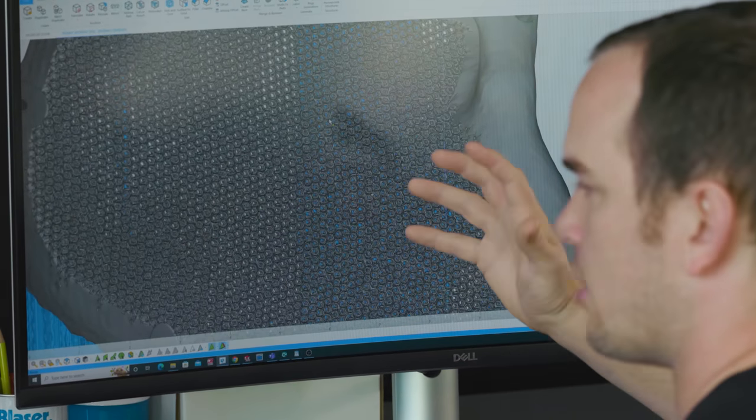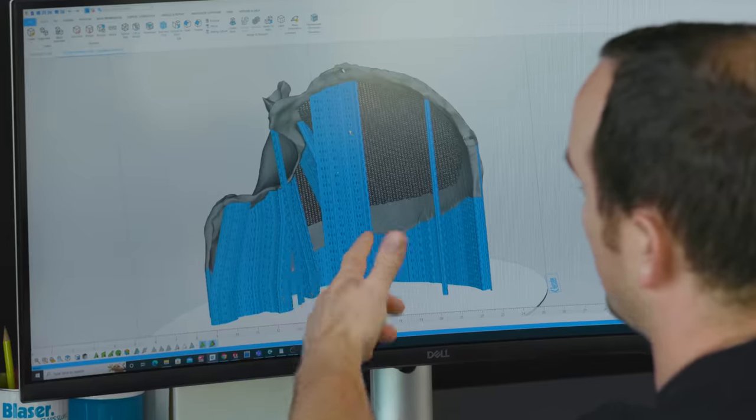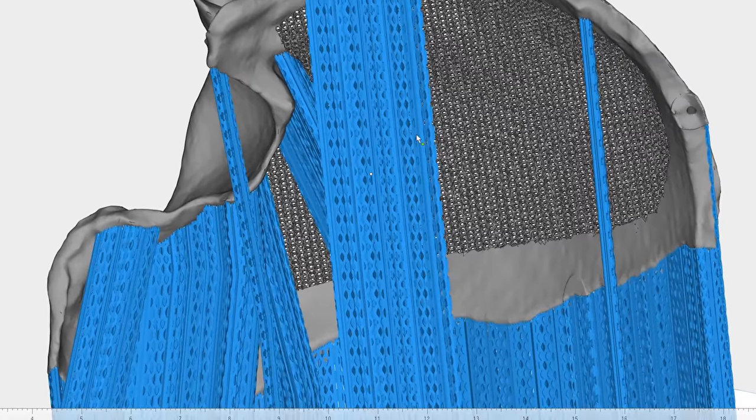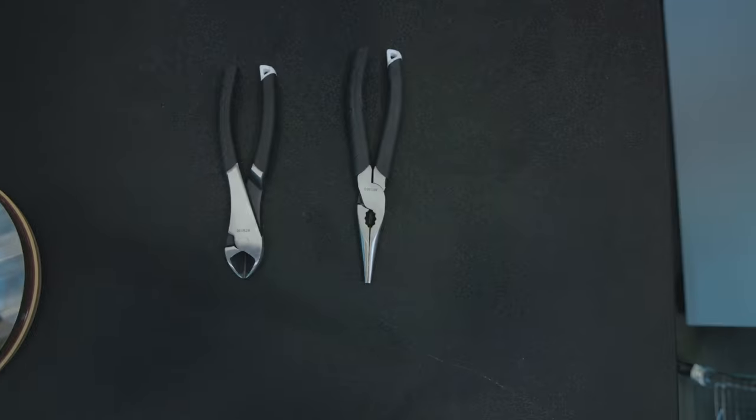The reason the lattice structures are better is because they're intertwined with each other, and doctors have found that actually helps create bone ingrowth after your surgery. This mesh pattern doesn't add any additional manufacturing costs. It's a little more difficult on the design side, but with metal 3D printing, we can easily accomplish this on the manufacturing side. Our support structures also have a bit of a mesh pattern, and that's great because we can break these away using simple hand tools after the print's done.